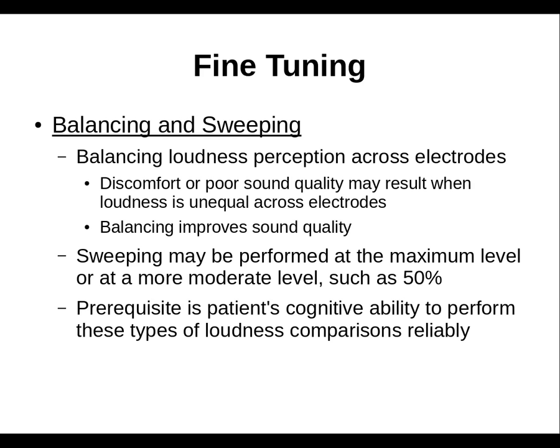Sweeping is related to that. That's just the process of moving from one electrode to another, presenting a fixed stimulus. It may be at near the maximum level, it may be at 50% of the electrical dynamic range, but it's just sweeping from one electrode to another, kind of like when we sweep MPO for hearing aids, making sure that loudness is equal across, or that at least that there's no discomfort when they're sweeping at a maximum level.